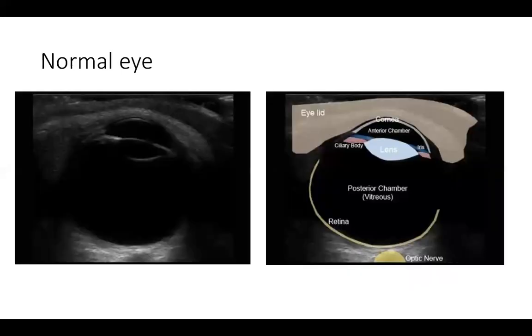Now let's see what that looks like on ultrasound. This is an image of a normal eye — the cornea is at the top of your screen closest to your transducer, you're seeing the lens below that and then the posterior chamber or the vitreous, and we want to see the optic nerve just posterior to that posterior chamber.